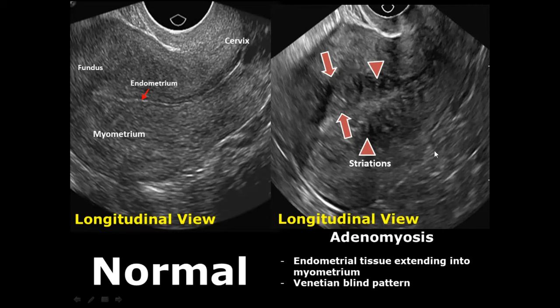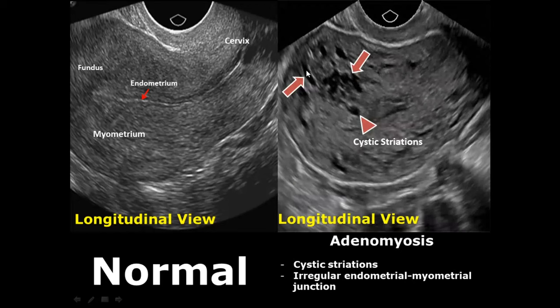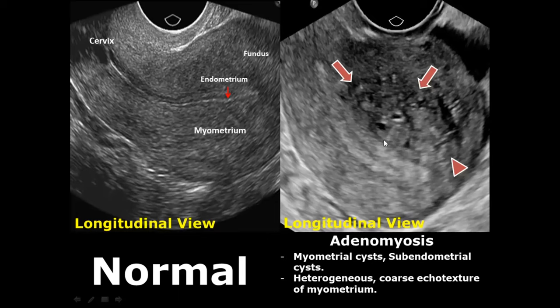Adenomyosis is the presence of endometrial tissue within the myometrium. It shows a typical appearance called the 'Venetian blind pattern,' which has alternating bright and dark bands in the myometrial area. It can also present with cystic striations, irregular endometrial-myometrial junction, myometrial cysts, subendometrial cysts, and a general heterogeneous echotexture.